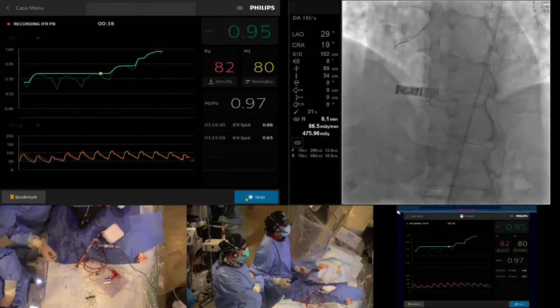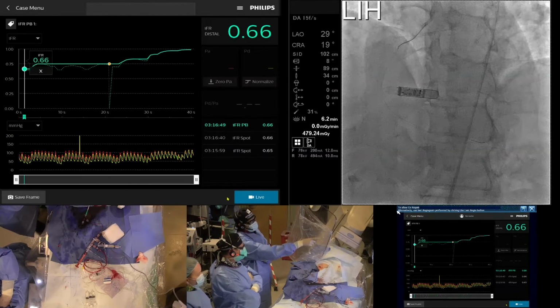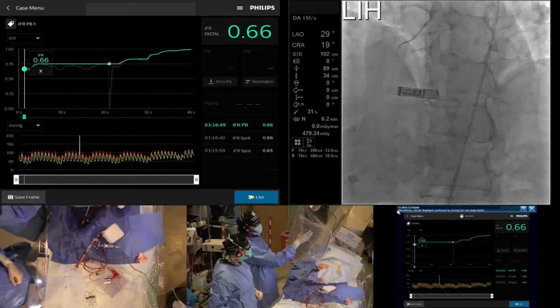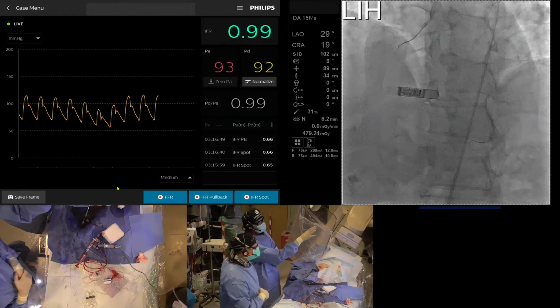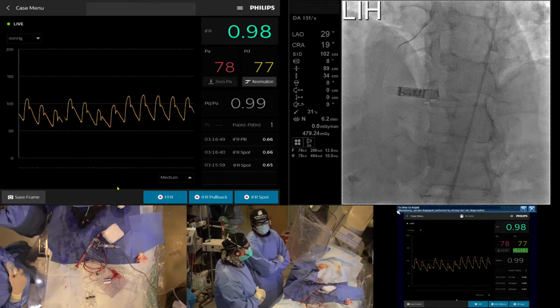Disengage my guide there. Now, let's do one injection here. So I just want to make a point. You saw how I disengaged? Can you restore that? Maybe we can show people after. I disengaged my guide as I came back up. Make sure that I was disengaged, and you can see our PdPa is now 0.99, so there's essentially zero drift.